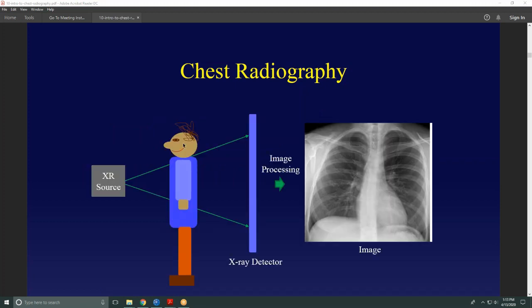So shown here is my high resolution image of a human being imaged using an X-ray. You'll notice you've got your X-ray source. The X-rays are transmitted through the person's body onto a detector. I don't know if any of you remember film cameras, probably before a lot of your times, but what you basically have here is the photographic negative of the image, where the dark areas are exposed to a lot of X-rays and the lighter areas are not exposed to any X-rays. So that's kind of why we have the color coding scheme we do. This is basically the negative of an image, similar to the images acquired using film on a camera.